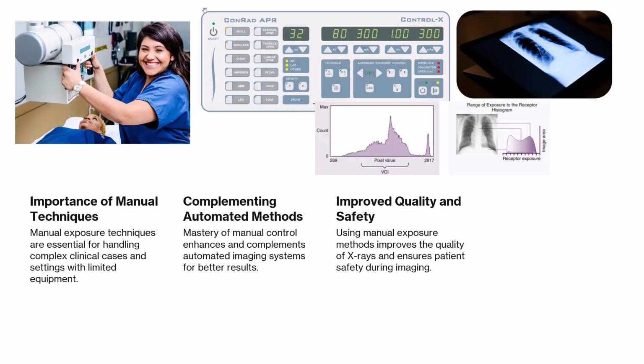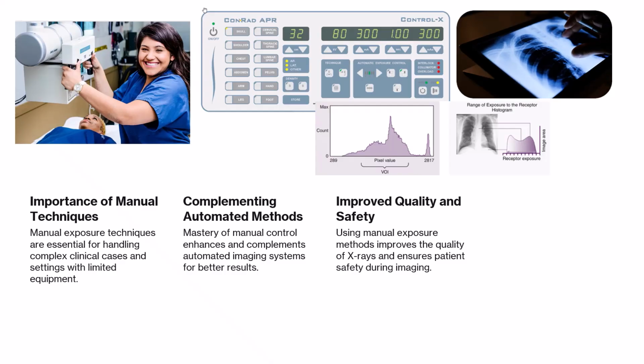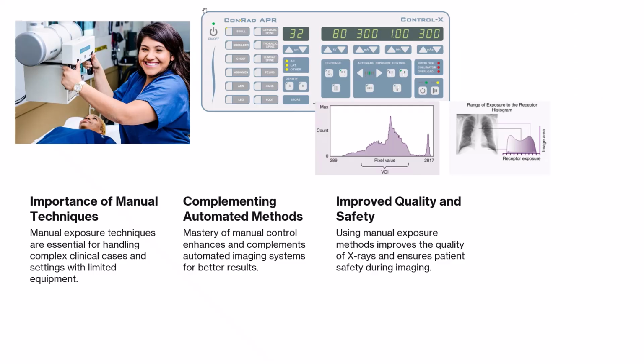Manual exposure techniques remain critical in X-ray imaging, particularly in complex situations and equipment-limited environments. Mastery of manual control complements automated methods and enhances imaging quality and safety.